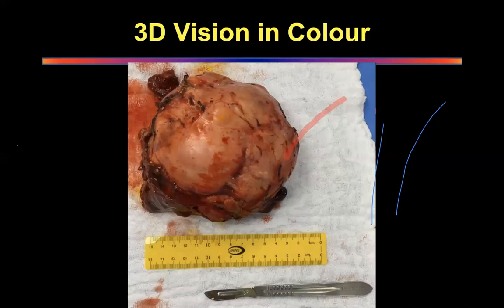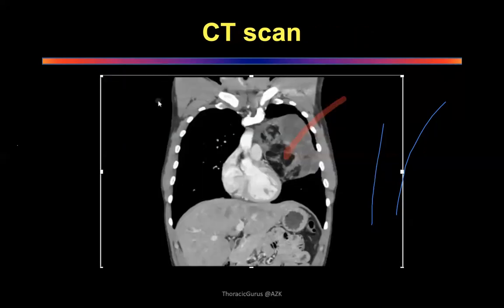And if this picture doesn't come in your mind, then you have not become a good clinician. Okay? So please, please, please learn to make the picture in your mind. That is the only difference between you seeing the CT scan and me seeing the CT scan. When I see this mass compressing on this vascular structure, I am able to make an image in my mind of the compression on the pulmonary artery or aorta or whatever it is. I can clearly visualize this because I have 3D training. I've trained my mind to think 3D, not 2D.